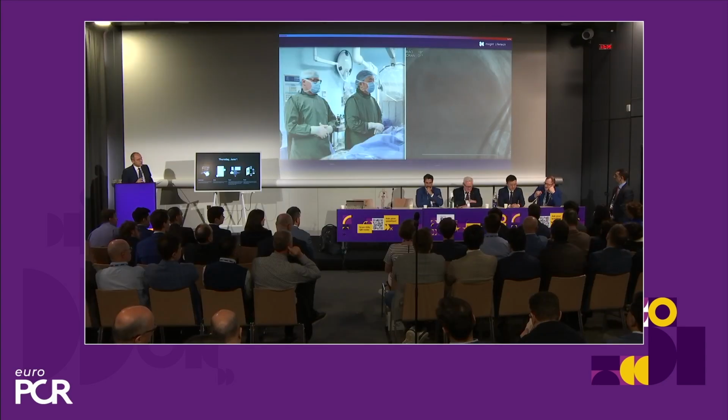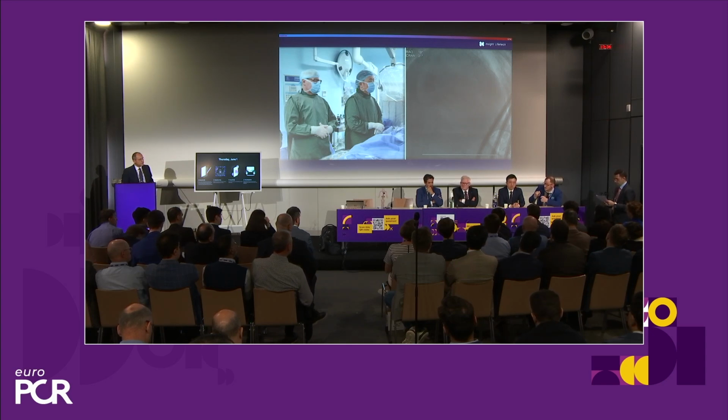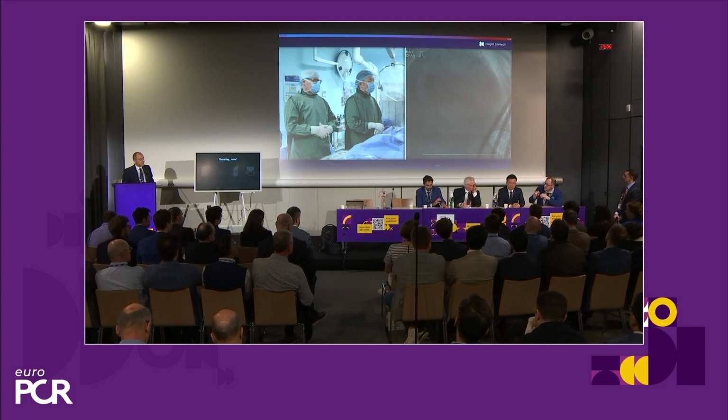To Felix, at the end of the table there, what's your guess? Anything different from what you heard so far you would do? So it's a long lesion, it's a 44-year-old. So first for discrimination of if you want to treat it or you have to treat it, physiology. If you have to treat it, use the IVUS to optimize it. You want a long-lasting result, you may get away with less stenting if you do imaging, so just treat the culprit if you have to, but this has to be demanded or directed by physiology.